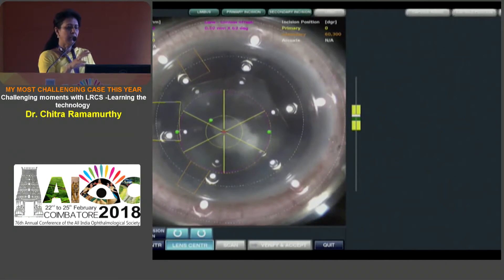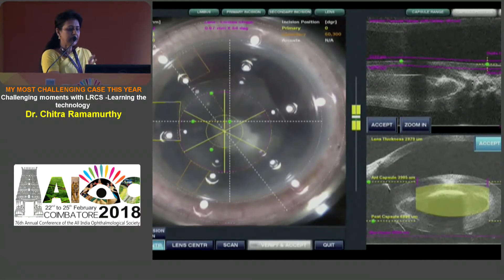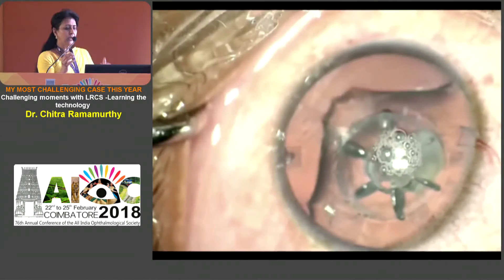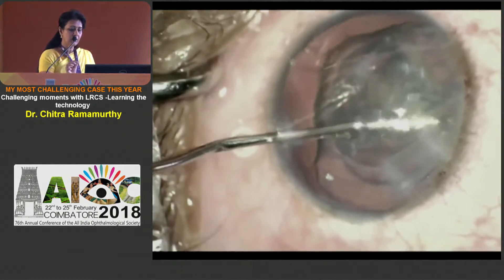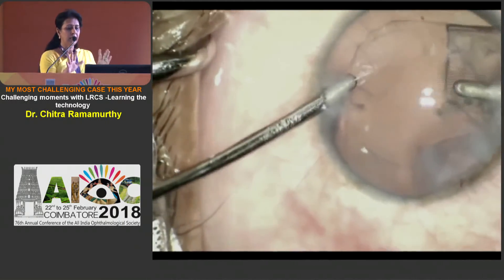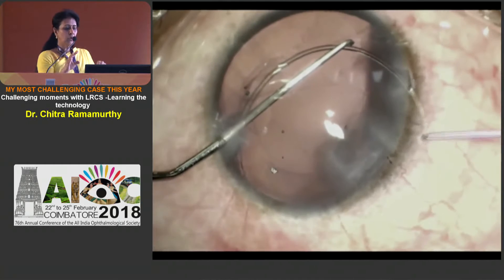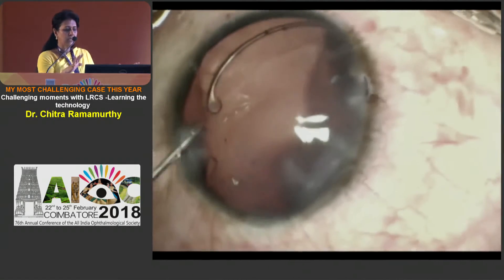This was the next situation — a significant subluxation, just held in some areas with the zonular fibers. So I decenter my rhexis on the femtocataract platform, because once it is centered to the scleral wall, the little decentration at this point of time is mandatory. Again, the segmentation and softening has been done, and here again I use my capsule rhexis needle to create the rhexis. It's a very soft cataract and it just comes up. It's very important at all times that the AC should not shallow, to increase the area of dialysis. I strip the cortex in the most gentle fashion, then go in with a CTR and position it such that the long arm of the CTR comes to overlie the area of maximum zonular loss.